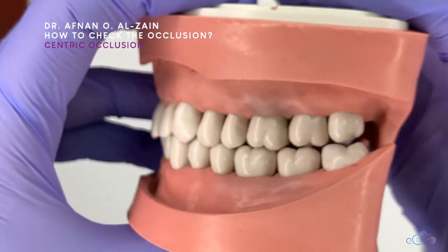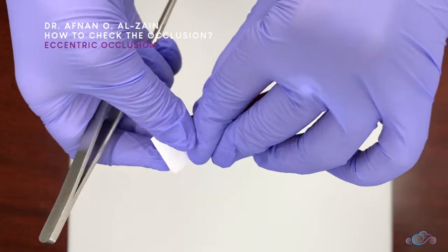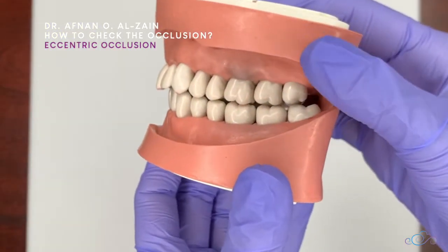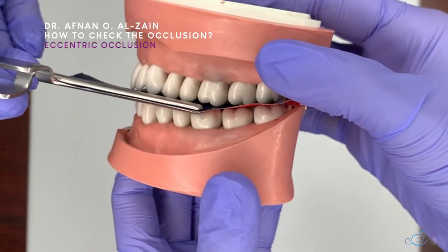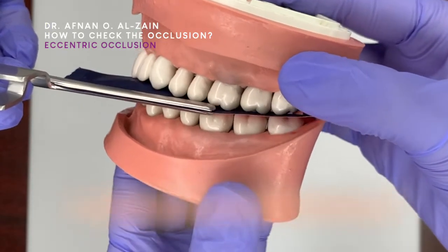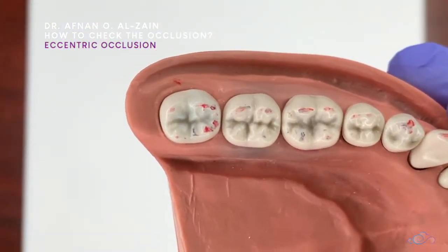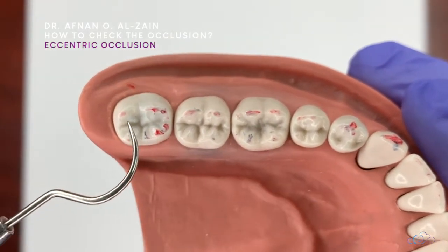To check for eccentric movement, flip the articulating paper in the holder to switch the color. Place it in the patient's mouth with the reverse color and ask the patient to perform protrusive, retrusive, and side-to-side movements to simulate the chewing motion. After that, check the markings again — all markings should be similar to those recorded before restoring the tooth.